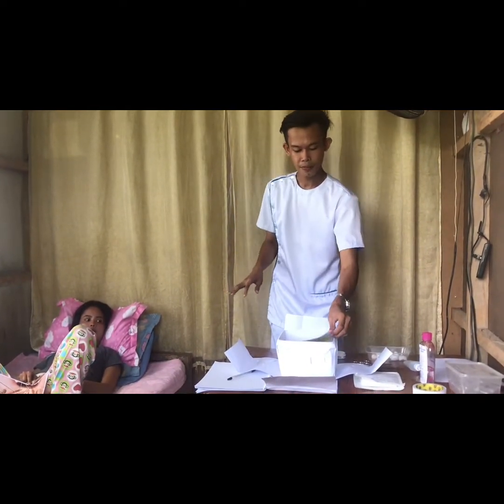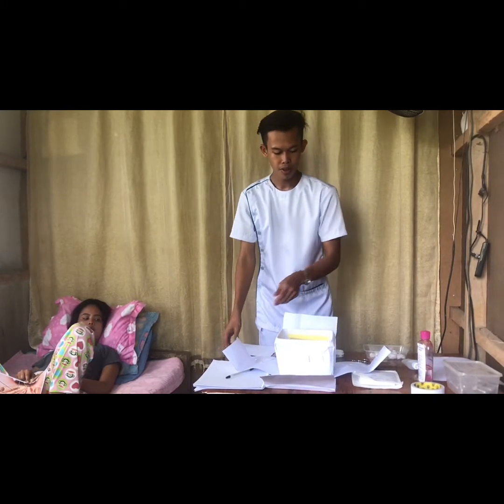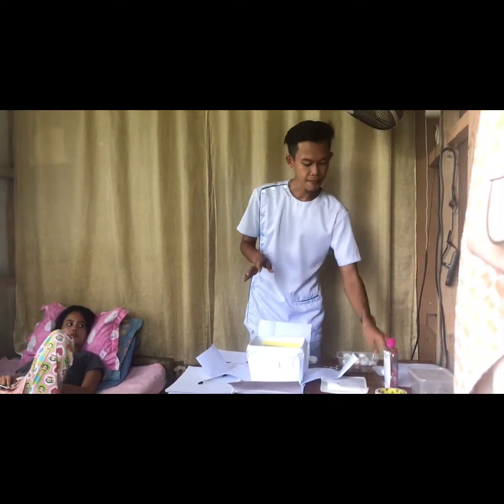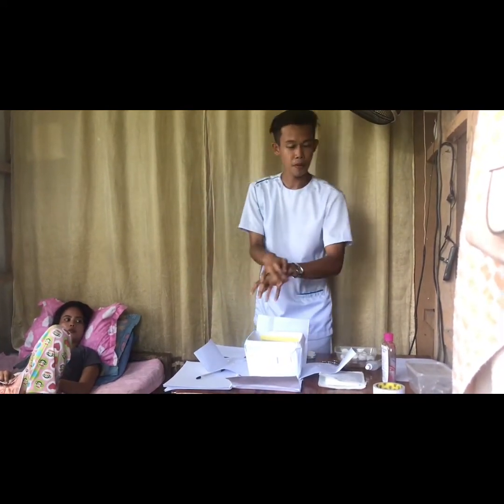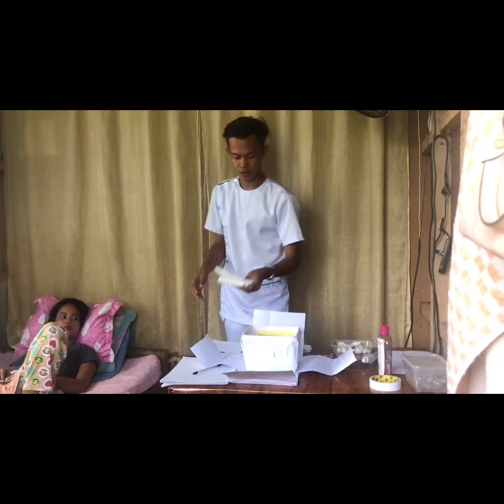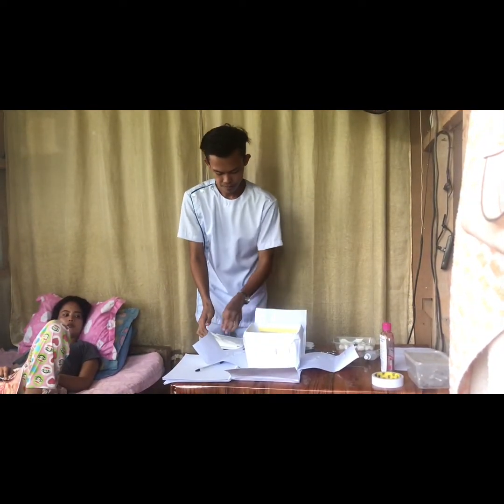So for this time, okay, the equipment inside the catheter kit is now exposed. So for this time, I'm going to sanitize my hands again, because for this time I'm going to wear or don my gloves. This is sterile gloves.